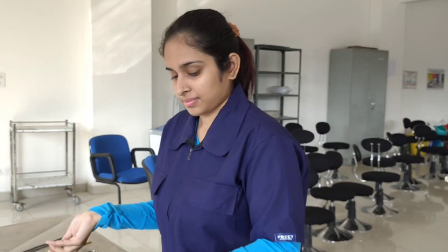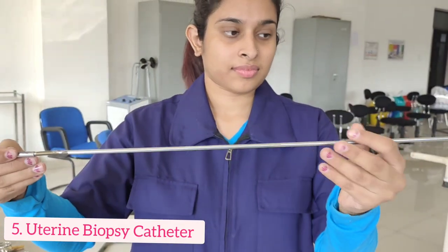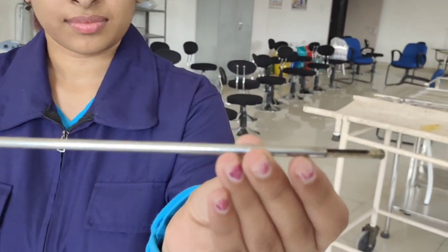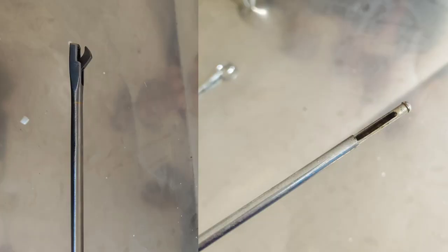Next we have another instrument to extract biopsy samples called the uterine biopsy catheter. In contrast to the punch, this one has a larger space to hold a greater amount of sample in it, and therefore the chances of injury in this case are higher.